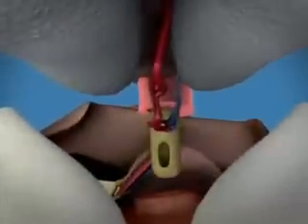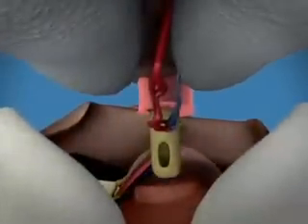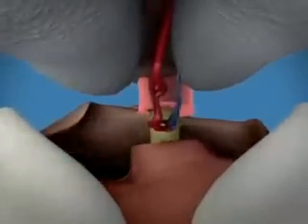The bladder neck and the urethra are now carefully sutured together so that the nerves are not trapped in the suturing and the operation can be completed.